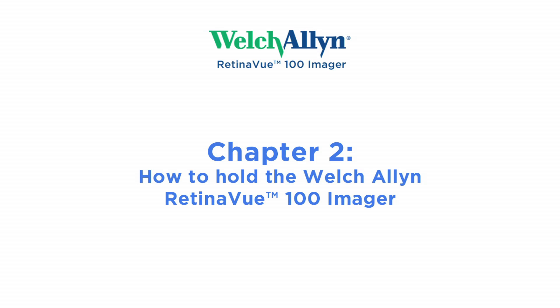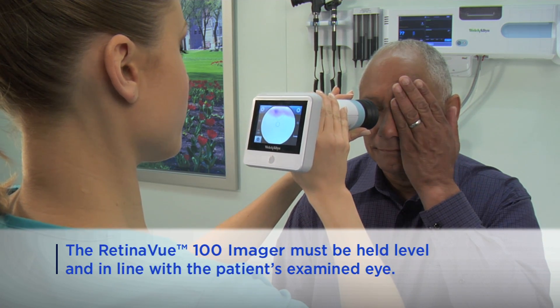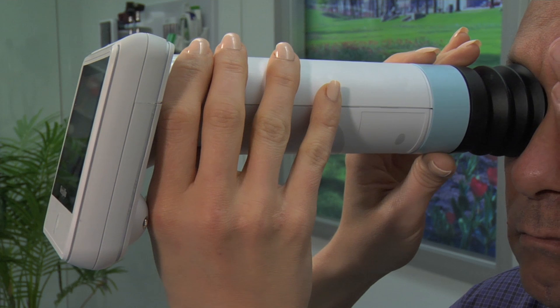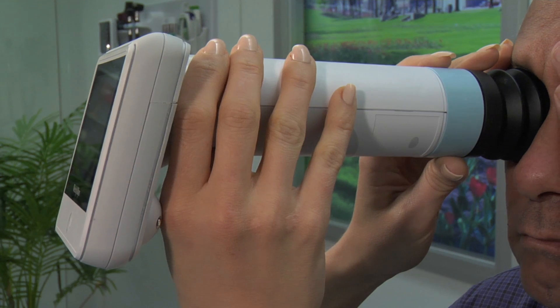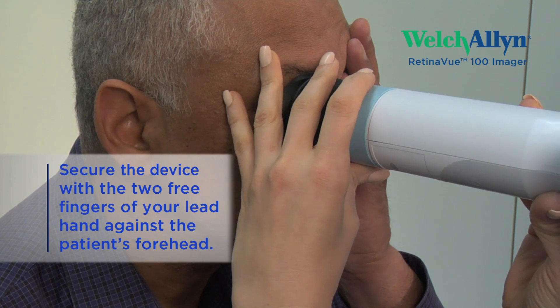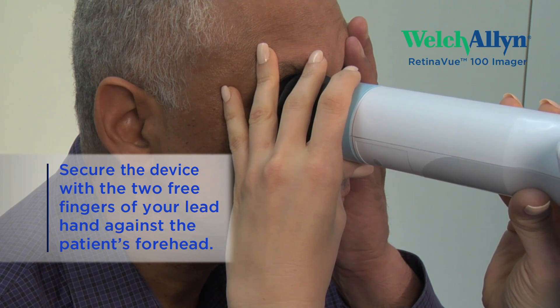Chapter 2: How to Hold the Welch-Allen RetinaView Imager. The RV100 must be held level and in line with your patient's eye. Hold the display end of the RV100 as shown here with your dominant hand. The patient end of the device will be held with just the thumb and forefinger. The small and ring finger will be used to steady the device by anchoring them gently on the patient's forehead.